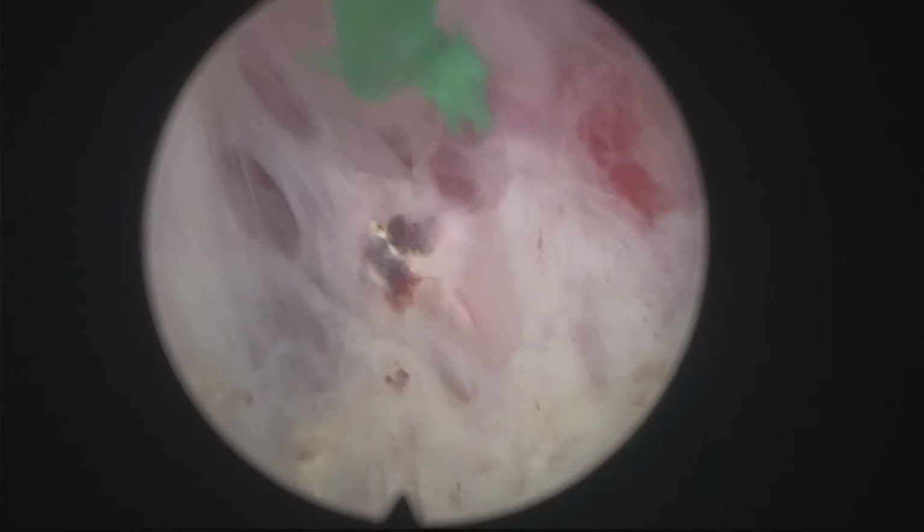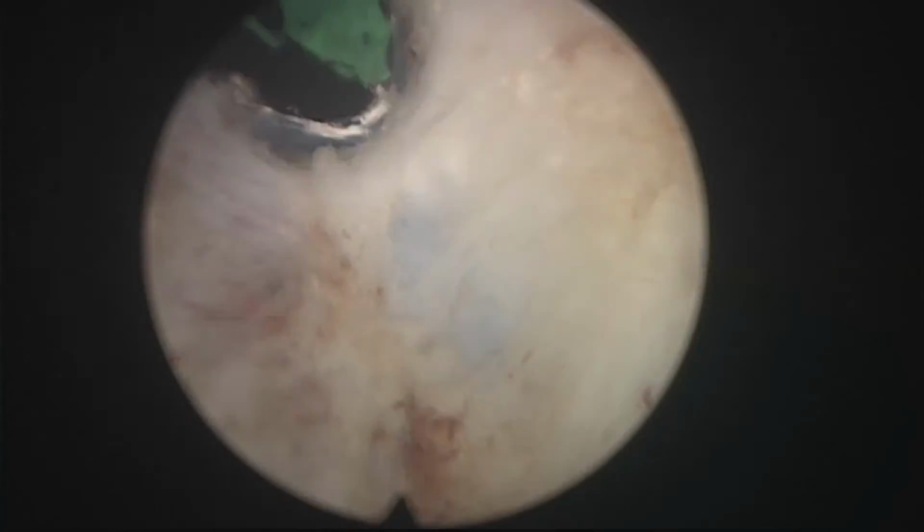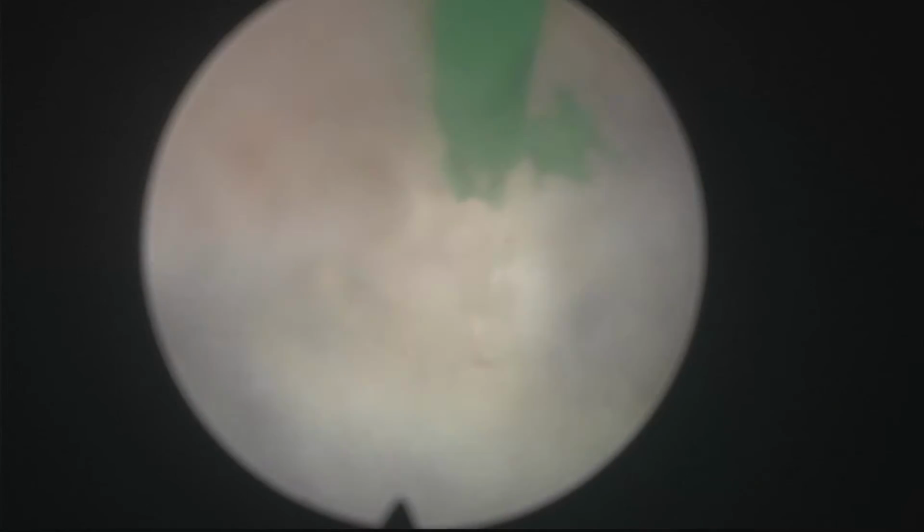You see how maybe in some areas you can go near the peripheral zone laterally, and if you see that you're going too deep, then you have to correct a little bit, medialize the fiber, the incision, so the targeting of the laser has to be corrected to try to adapt to the anatomy. So this is now coming up to try to connect with the already opened bladder neck.